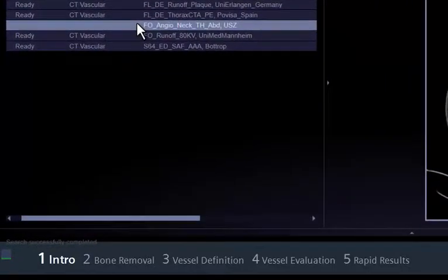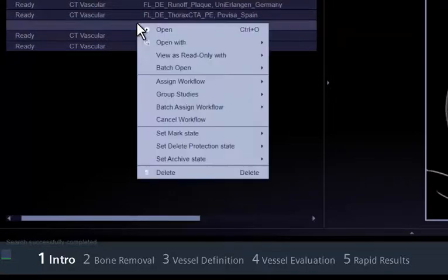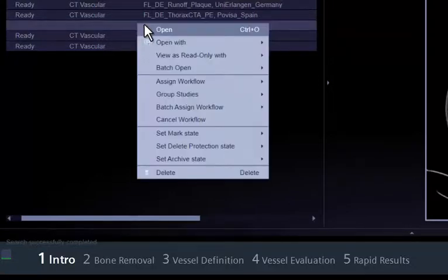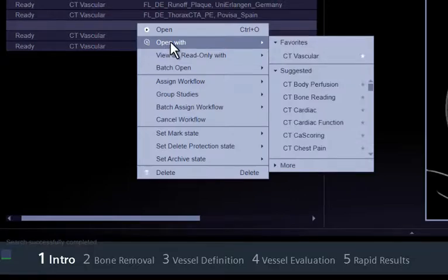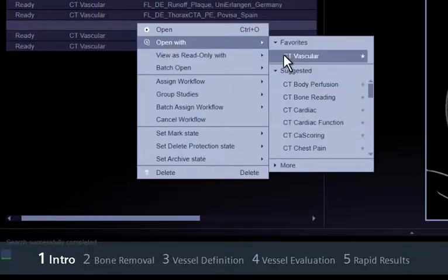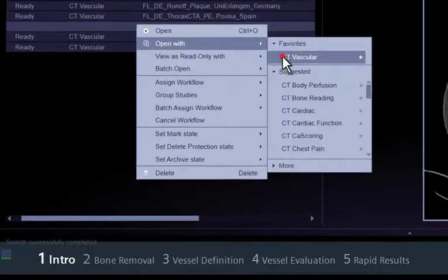First, make sure that the study is correctly assigned to the CT vascular workflow. Otherwise, click the right mouse button and select Open with CT Vascular.